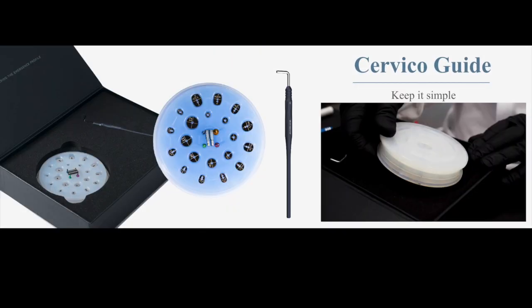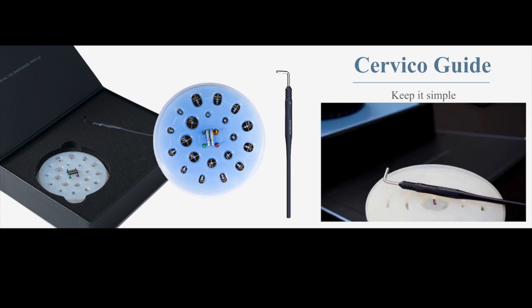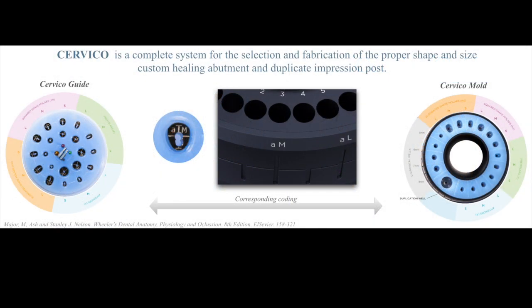And all the parts of the actual system itself, there's a little video here. It works on magnetic connection, okay? So this little video shows you how it's picked up. So on the actual guide itself, all the tabs have identification codes on them. And as you can see, I've blown up one of the photos there of one of the tabs and it says AM. It's anterior medium. Also, on the actual mold itself, which is this, all those codings are around here. So whatever coding is on the tabs is also on the actual ring in this area, because each coding is designated to the well of the mold. Okay, I think that makes it clear.